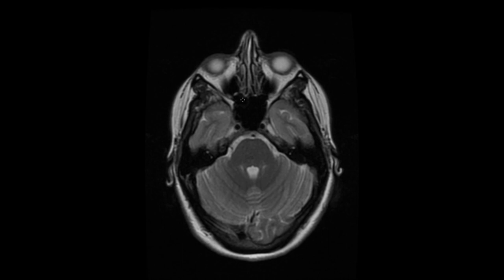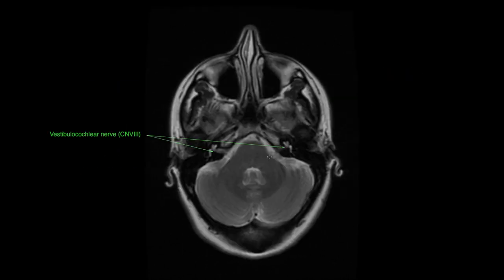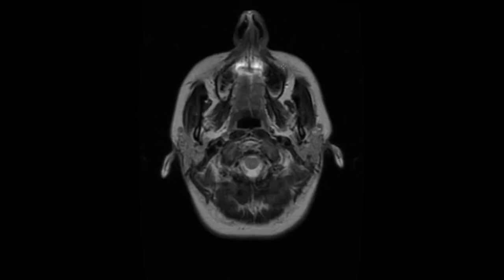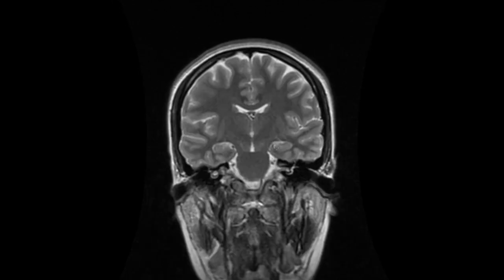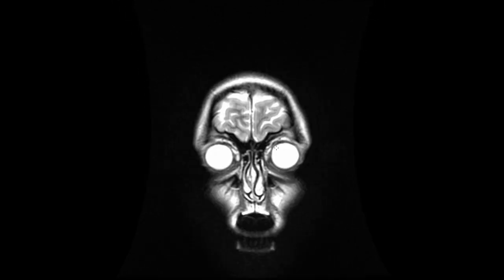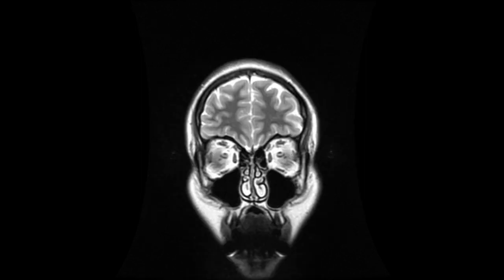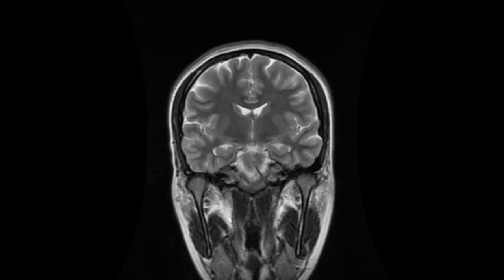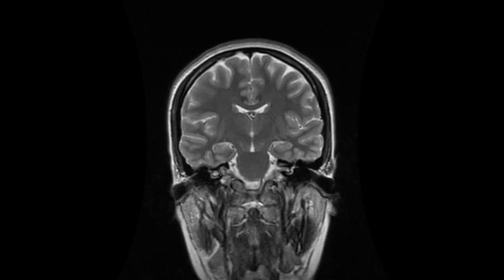Going further down, you have the vestibulocochlear nerve, which is cranial nerve eight — like little antennas with the attachment right to the brain. Maxillary sinuses are visible, and you can even see a couple of teeth. The coronal view isn't labeled, but gives you an idea of what it looks like. Rolling through to the anterior aspect, and going posterior, you'll be able to see the optic nerve in cross-section, the temporal lobes, and the cochlea.